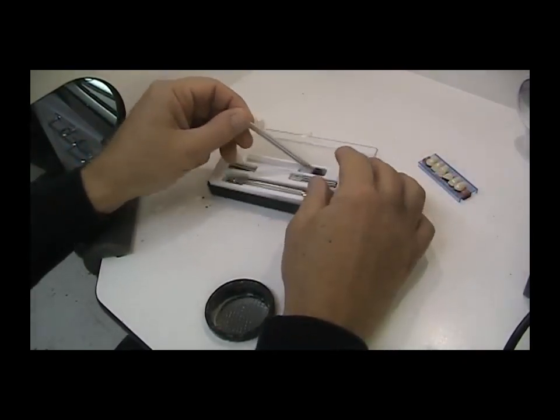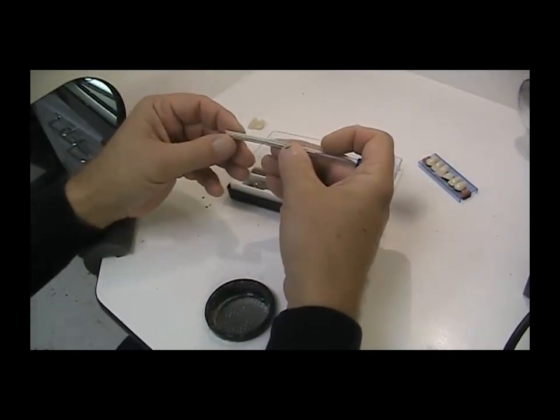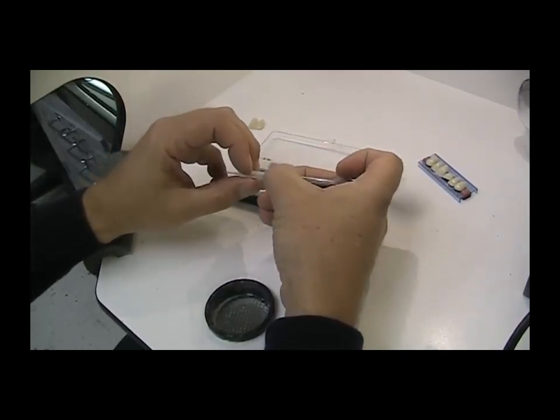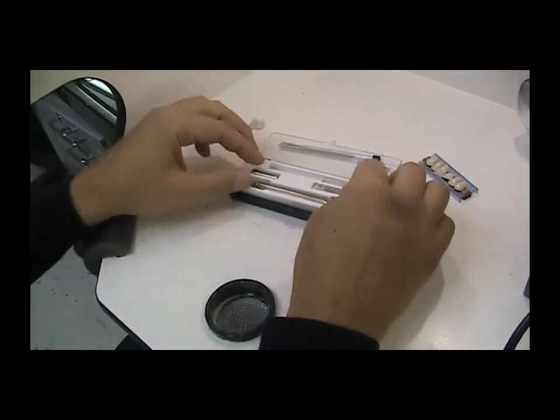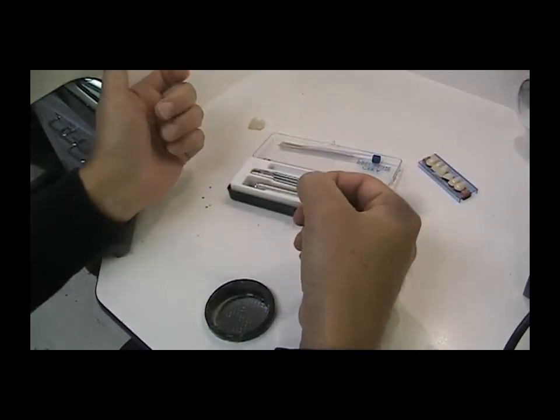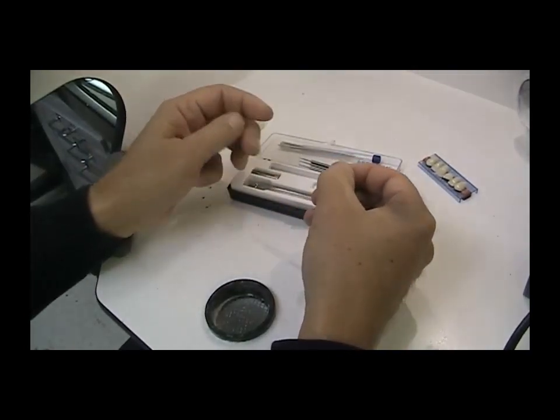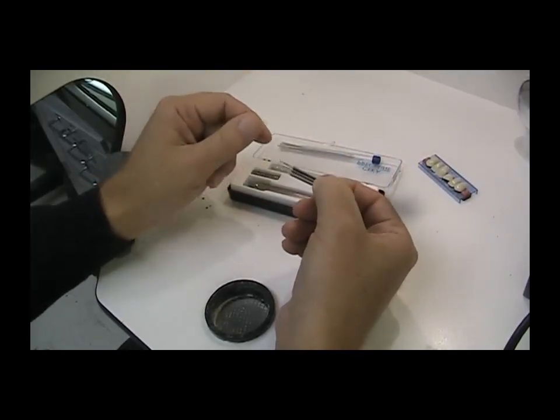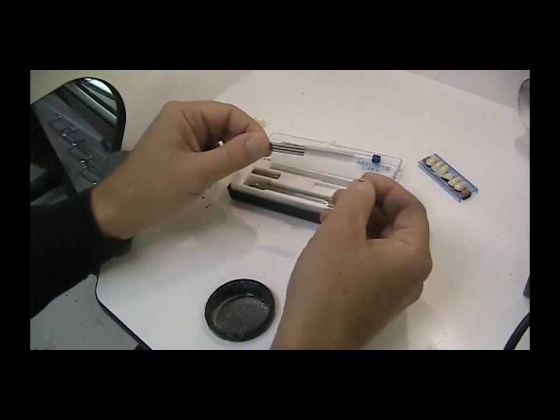First off, we have a bundle — I believe there are 10 of these rhodium wires. They're coated with silver and they also have threads on them. You also get three tap drills. You tap a hole, and the hole these produce is just a bit smaller than the wire themselves, which allows you to screw the wire into the back of the denture tooth.